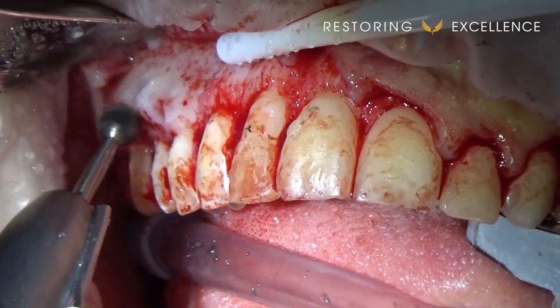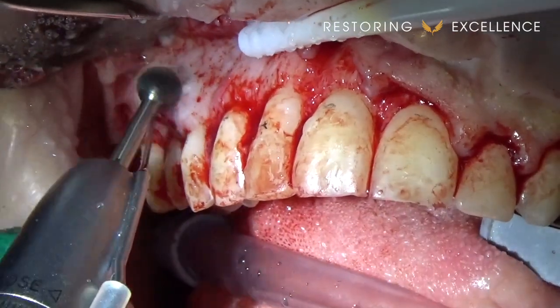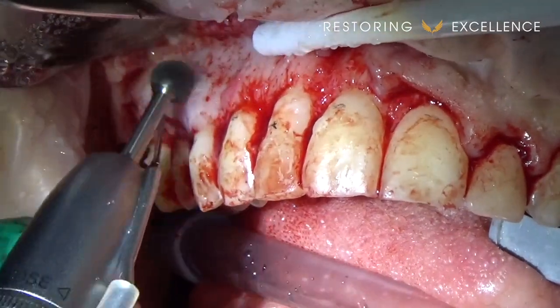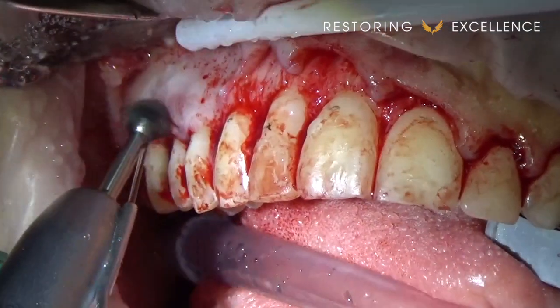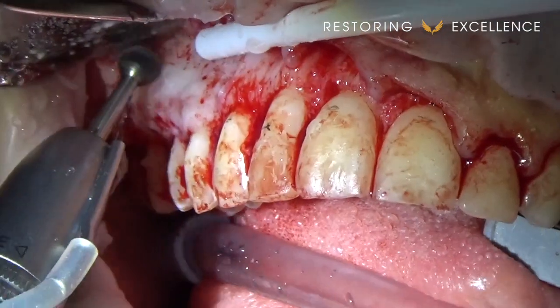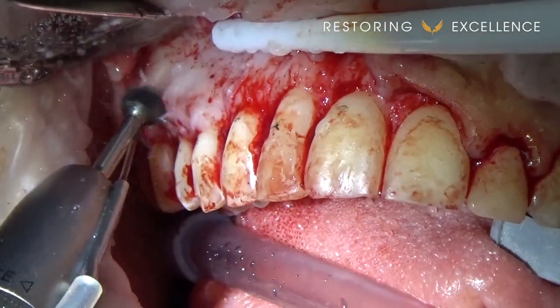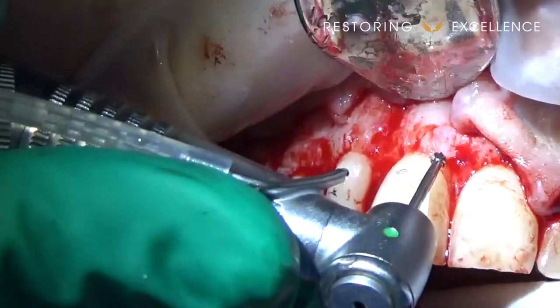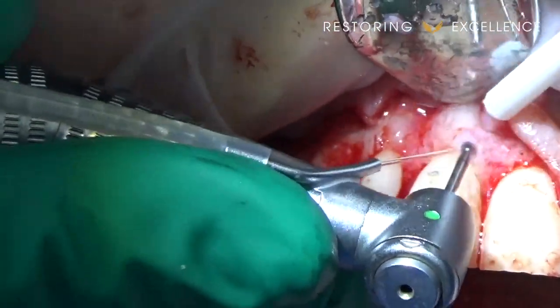This is a significant reason why the patient had inflamed tissues. The patient also had these massive exostoses that you can see here on the buccal of her premolars and molars, so we're re-contouring those.